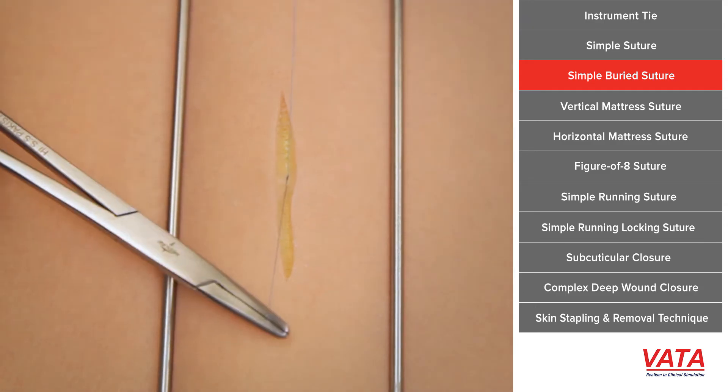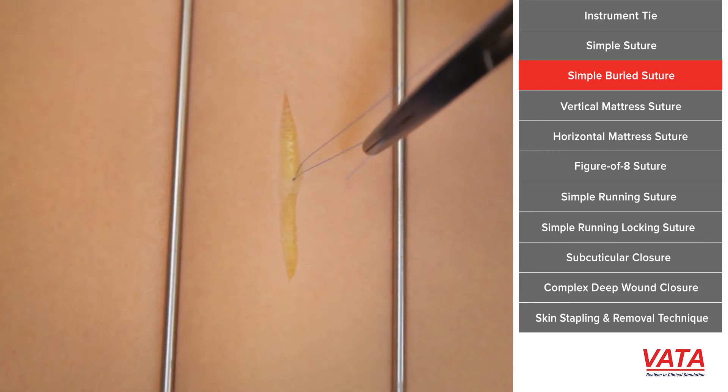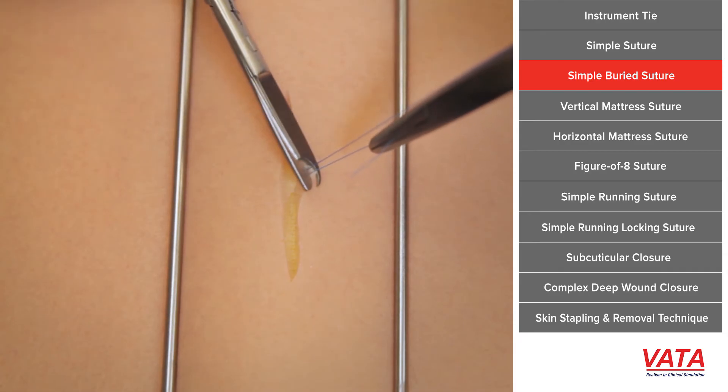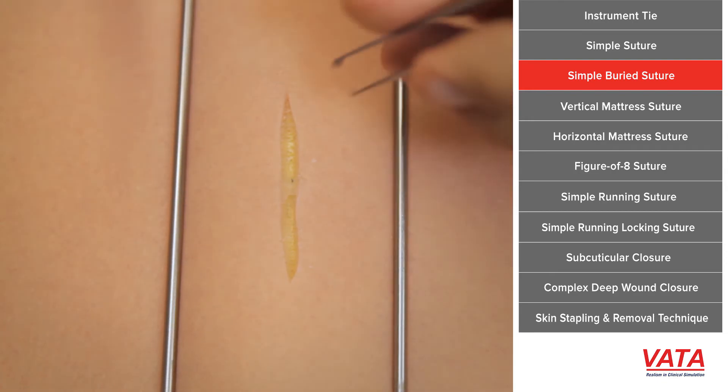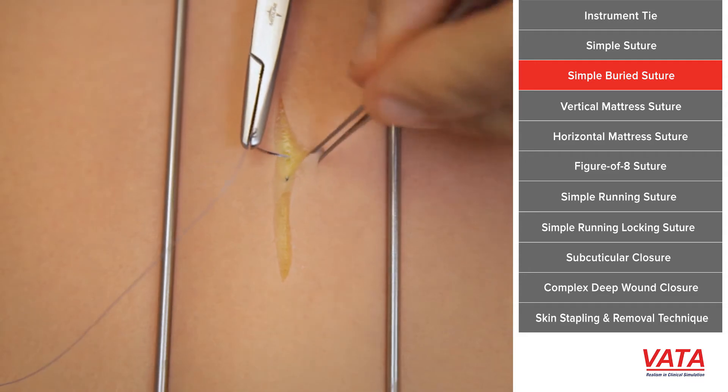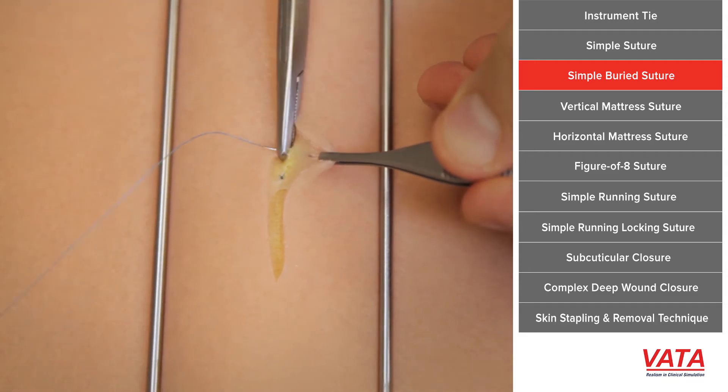What that's going to do when we tie this is it's going to pull everything together, but the knot itself is actually going to be underneath. This is important because we want to take all the tension off the skin, whether we're steri-stripping it or closing it with another suture, and we don't want these little ends of the suture to poke up through the skin — we call that spitting.